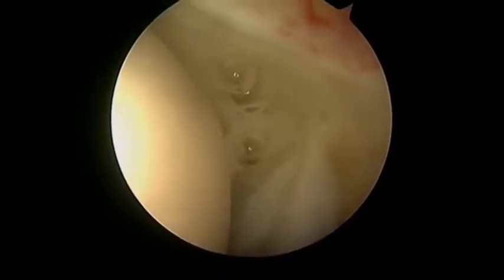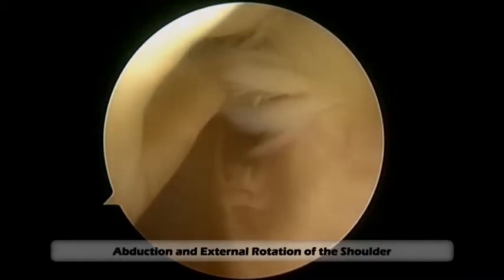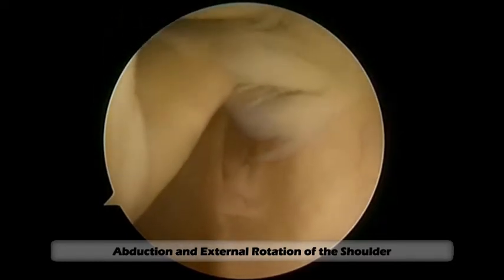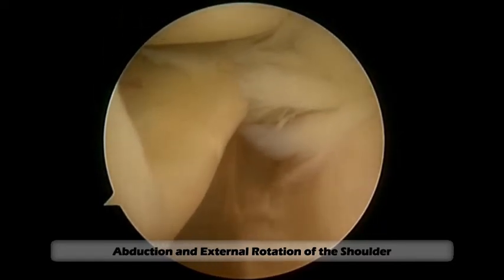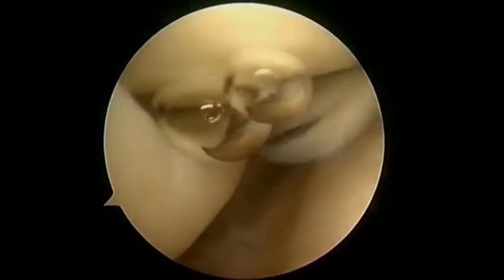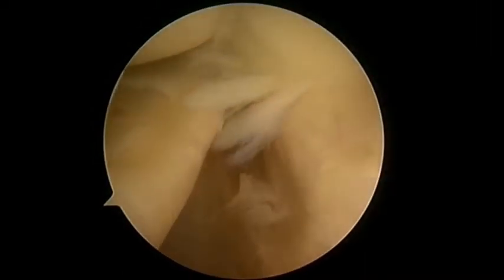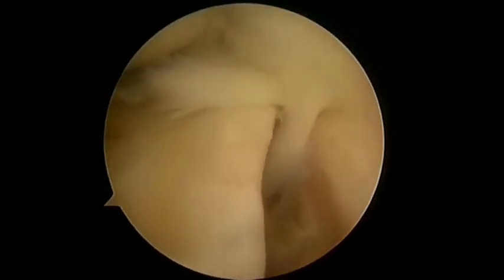The rotator cuff is also evaluated, and the arm is taken out of traction and placed in an abducted and externally rotated position to mimic the cocking phase of the throwing motion. It is evident from this dynamic arthroscopic evaluation that this pathology is consistent with internal impingement, as the undersurface of the rotator cuff impinges on the labrum.